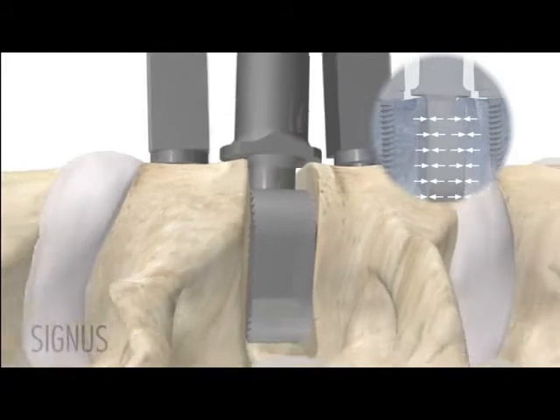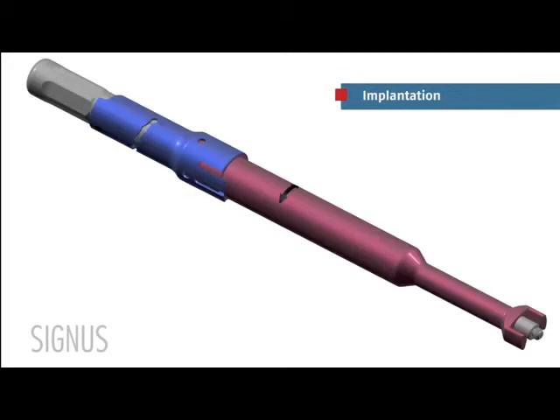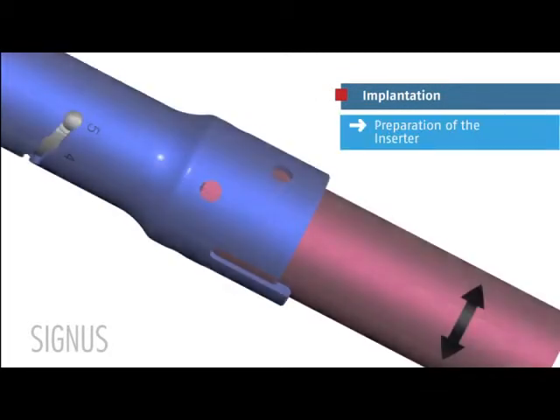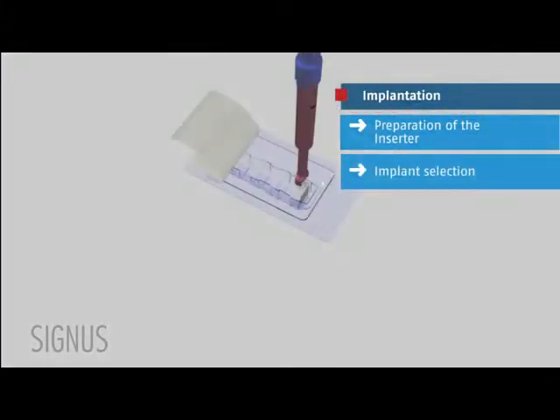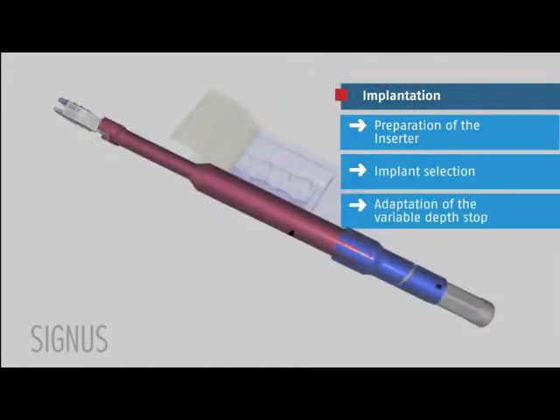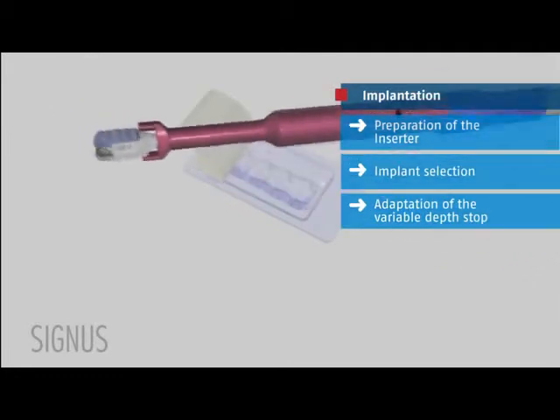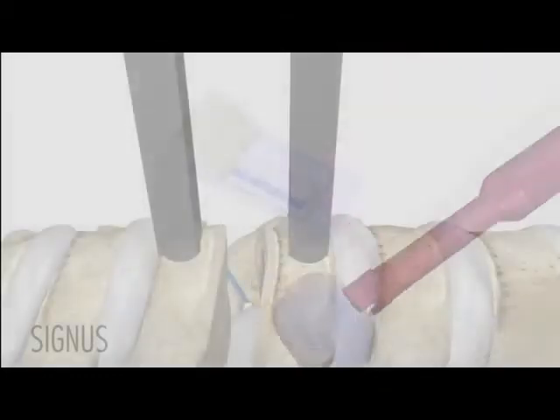The trial implant must lie flat on the vertebral end plates. Eventually, the end plates must be prepared further to ensure that they are parallel. The ROTAIO disc prosthesis is delivered pre-mounted on the inserter adapter. According to the sizing, the appropriate implant is introduced symmetrically about the vertical midline in the intervertebral space until the optimal position about 1 to 2 mm anterior to the posterior border of the vertebral body is achieved.